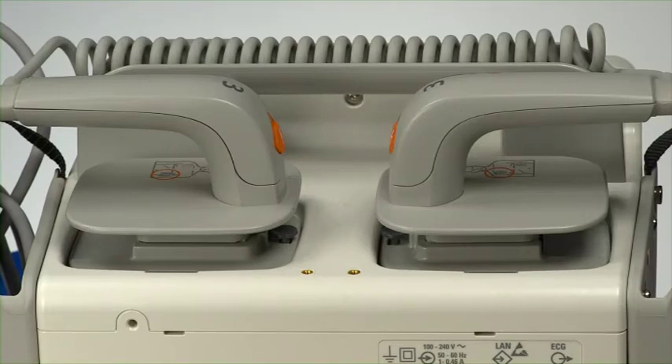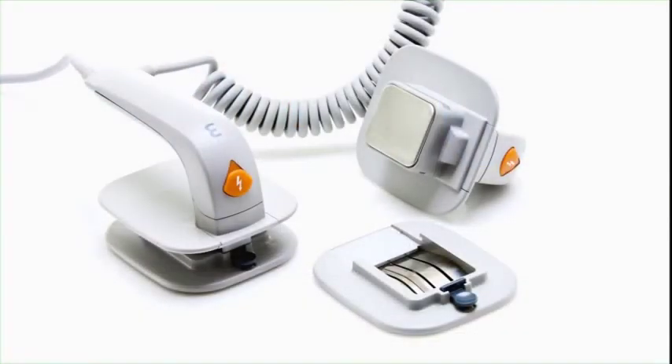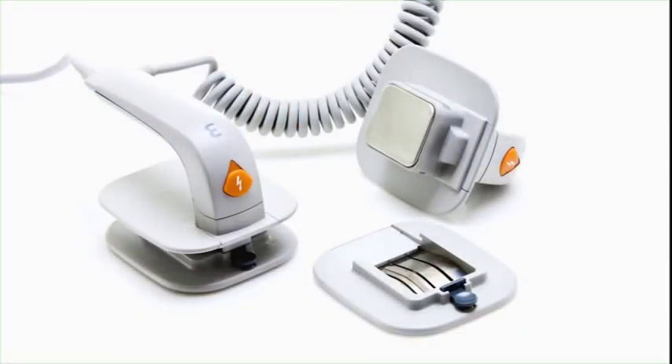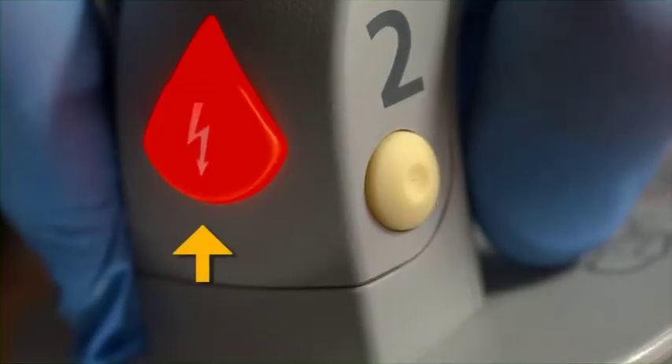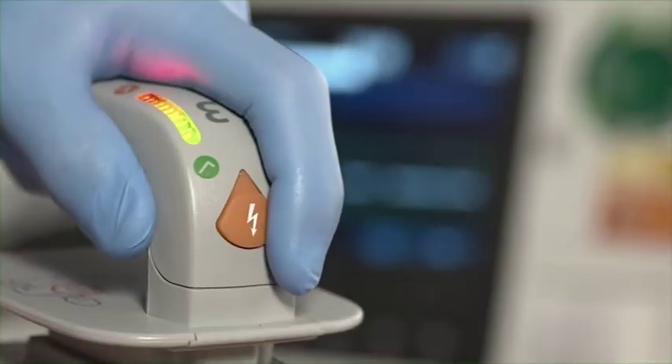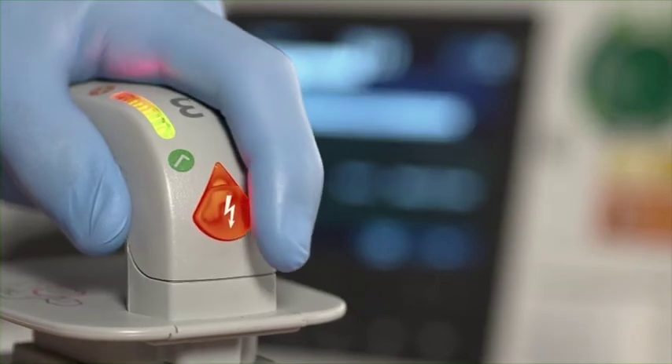The top of the HeartStart XL Plus consists of a handle and the optional external paddles. The XL Plus paddle set can be used on adult, child, and infant patients. Both paddles have orange shock buttons that flash when the defibrillator is charged, and the sternum paddle has a patient contact indicator light that lights green once proper skin contact is made.